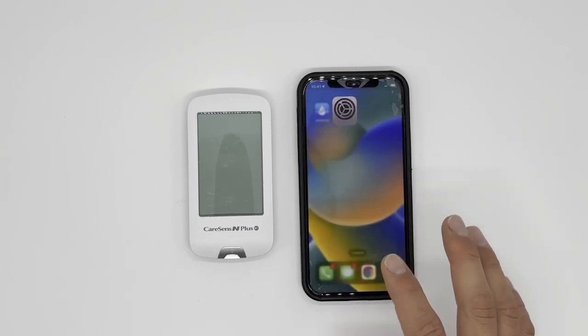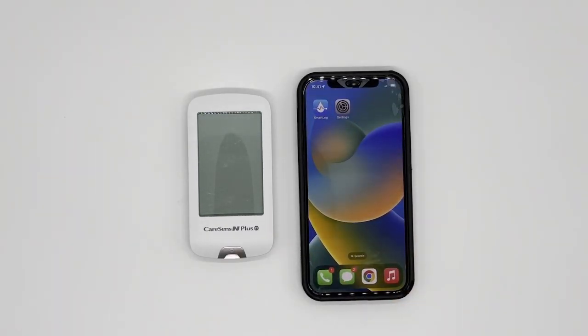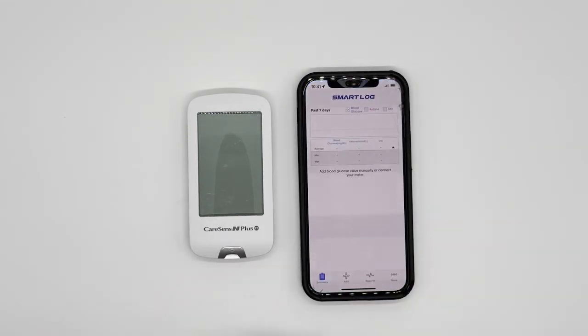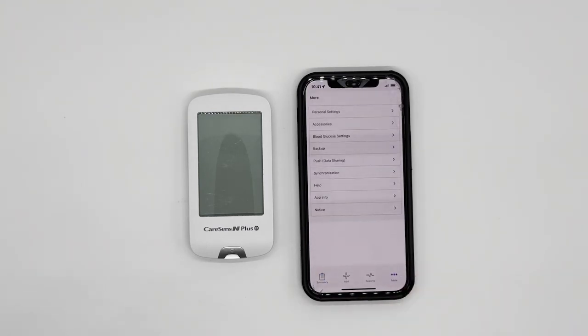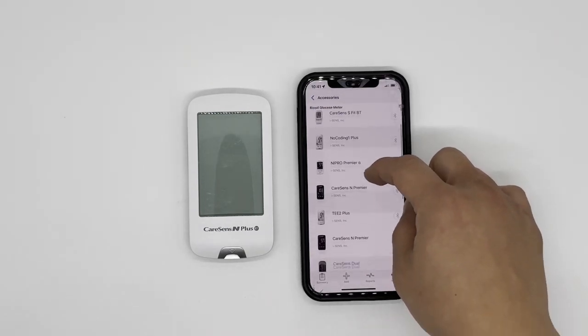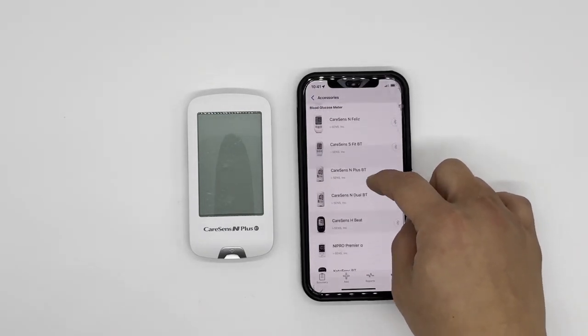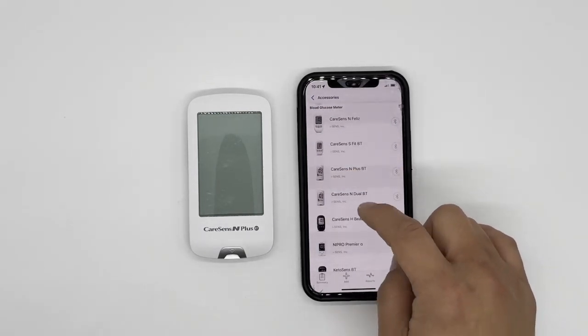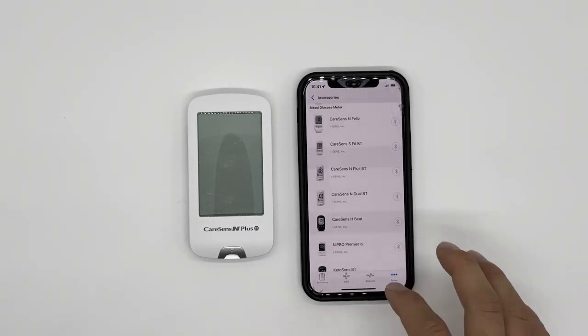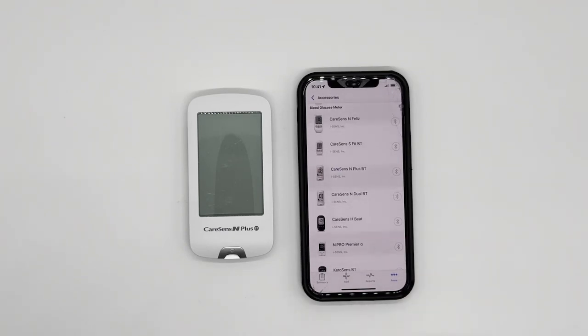Now this phone has no information about this meter whatsoever, so let's start the official process. Go to SmartLog — the main page. Go to More on the bottom right corner, second from the top, Accessories. Scroll down to find CareSense N Plus BT. If you don't see this on the list, it is important to update your app, which can also be found in the More option.